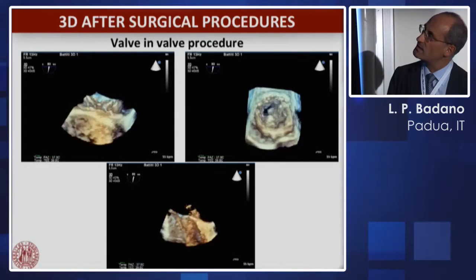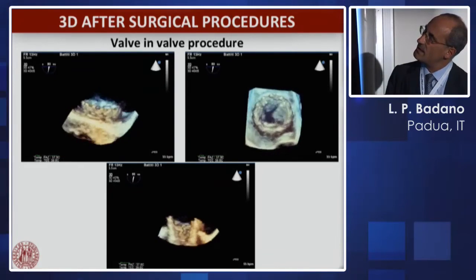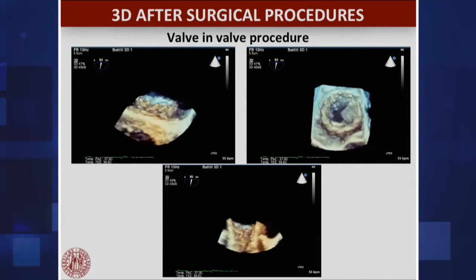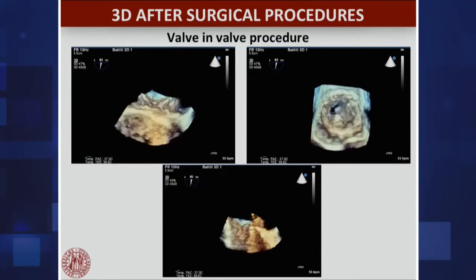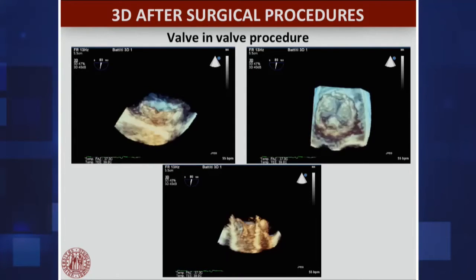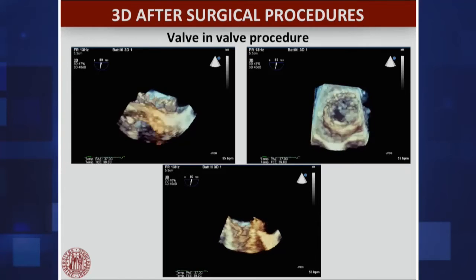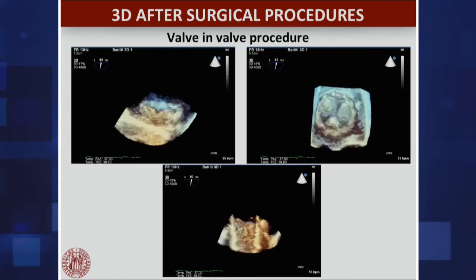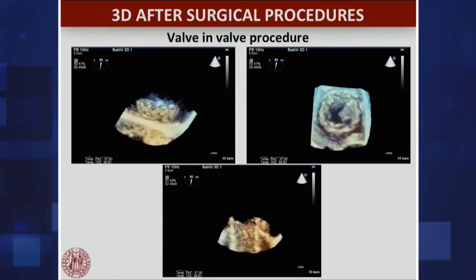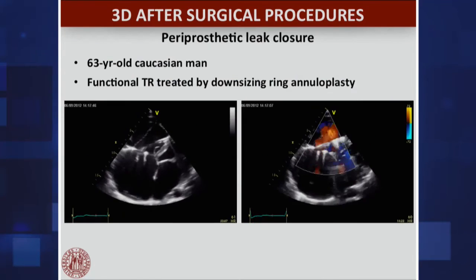But in this case, the patient was not doing that well, and it was not clear what happened. We performed this 3D transesophageal echo to see that for some reason, not all the leaflets were moving in the correct way. This one was stuck, and we were unable to understand the mechanism of that. It was quite strange to see this leaflet stuck in a bioprosthesis. So to check that it was not just a false image, we made a longitudinal cut of the valve to image the leaflet, and realized that indeed it was a non-moving leaflet, and so the patient required a further ballooning of the valve.